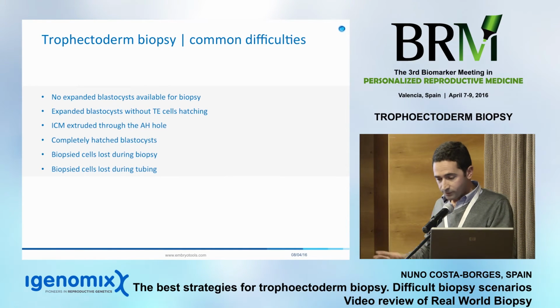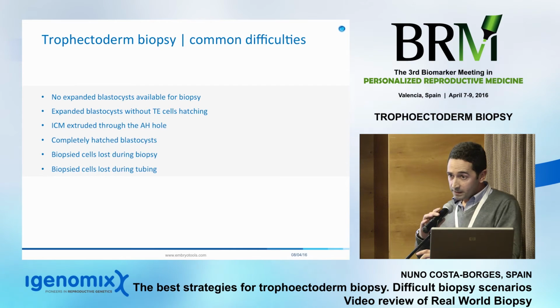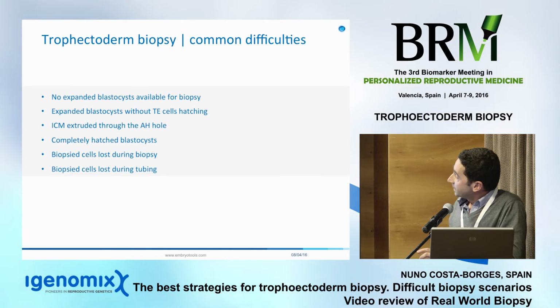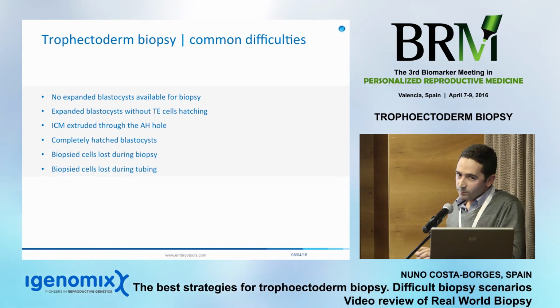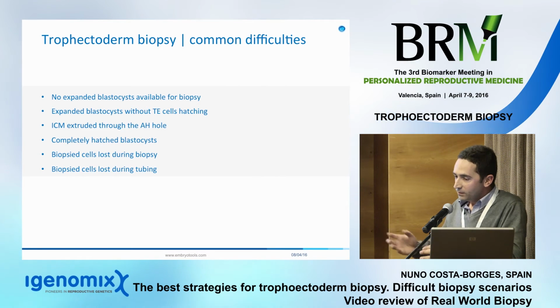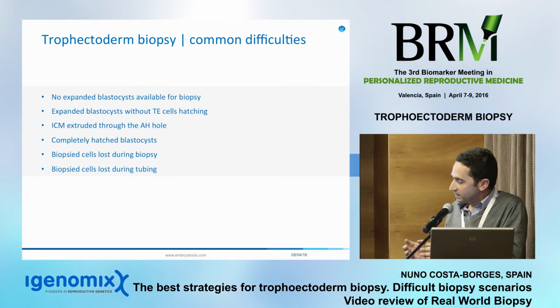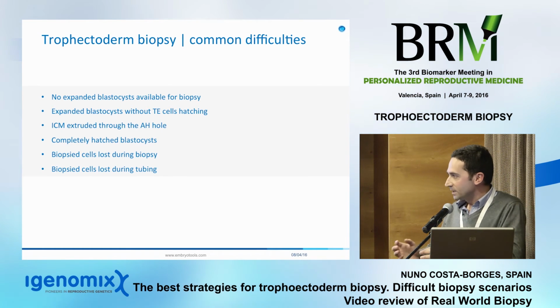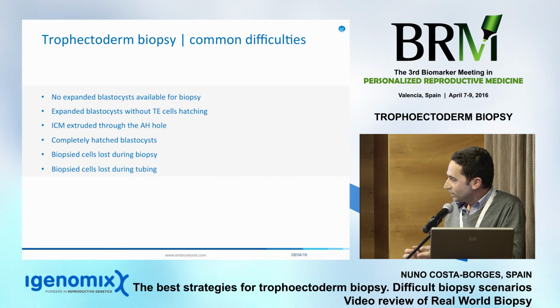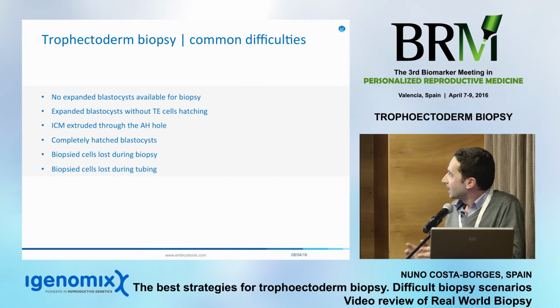These are the two methods that we use, and we can biopsy almost all embryos regardless of their developmental stage. But of course there are some problems, and you always have some difficulties because not all embryos are the same. This is probably one of the things that is more different than day 3 biopsy, because in day 3 you only need to find the right cell that you're going to take out. But here, with blastocysts, some collapse after the laser shot, others don't collapse. Others have just a few cells out of the zona. Others are still not blastocysts, so we cannot distinguish inner cell mass from trophectoderm cells.